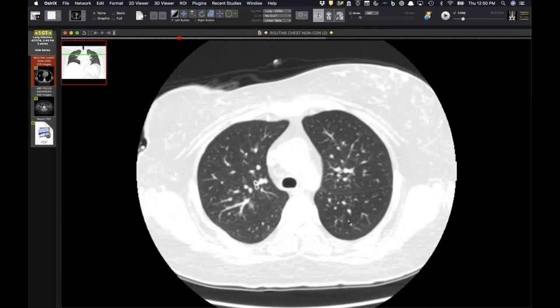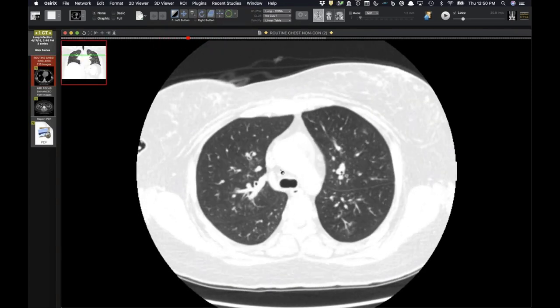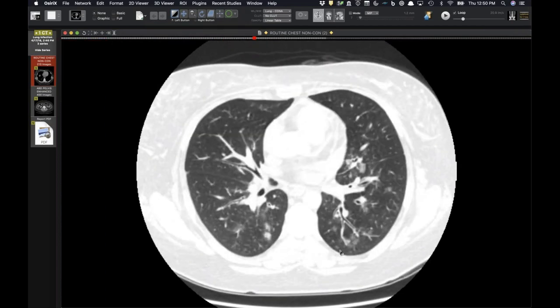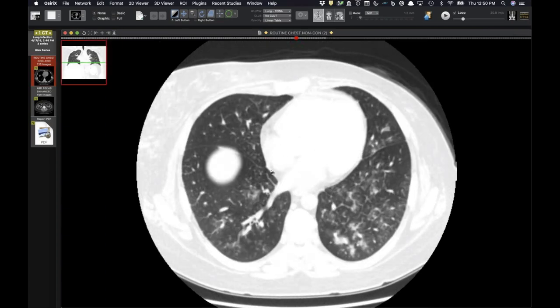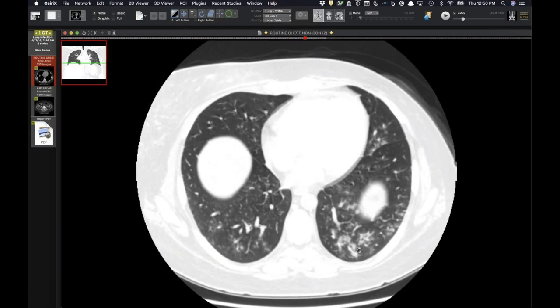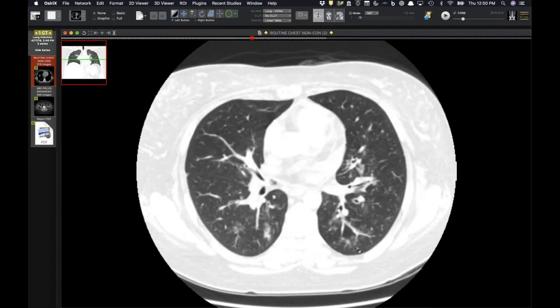So this was an influenza B positive case, and this is from a couple months ago, but I just now had it in here, and I just think it's nice to show. And also, especially now that we talk so much about exposures and inhalation, it's still multifocal, but geographically asymmetric and patchy in distribution, you've certainly got areas that are more normal, areas that are more severely affected. I guess with this one, you might think aspiration as well. I don't think the septal thickening goes that well for that, but certainly it's dependent.